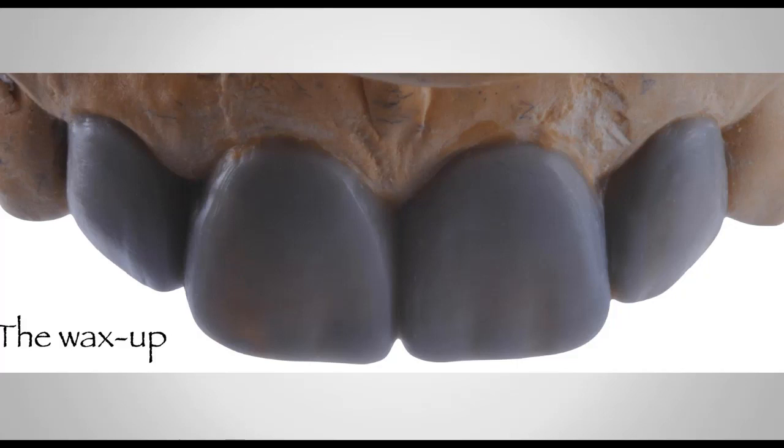So first, you've got to develop the wax-up, and this is exactly the same case. I want you to look at the canine number 6 and number 11, and I want you to see the amount of wax that I've been able to add to 7, 8, 9, and 10. If you look at this photo and you're kind of picky, you can see that right in this area of number 8, there's a little bit of stone showing through my wax. That is because I don't prep anything underneath the wax. This is definitely an additive case. All I need to do is add wax.